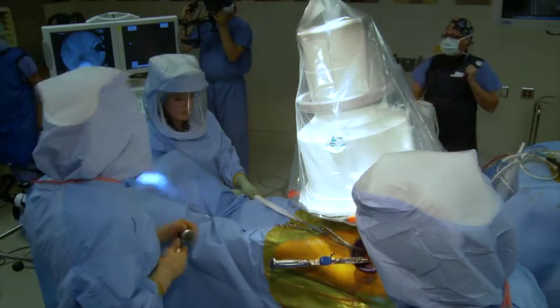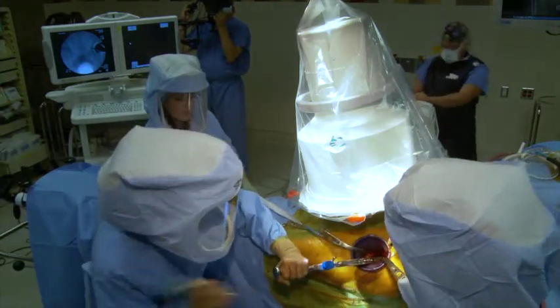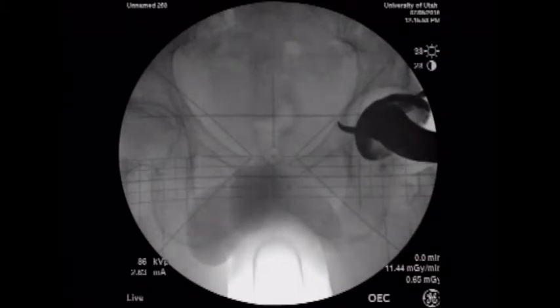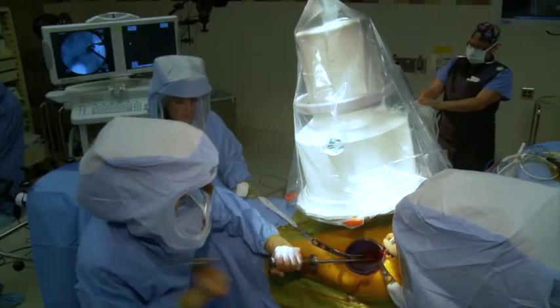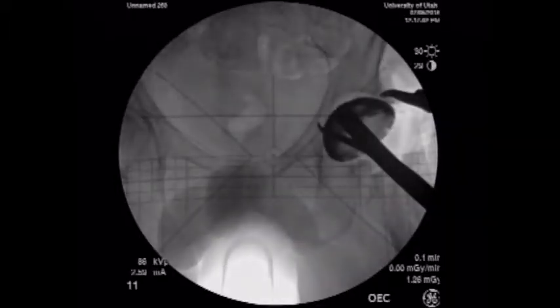I think our abduction and anteversion look pretty good. You know, we just got to get way down in that hole. Shot. Okay, I'm going to get the straight inserter because there's just no way without it on this dude. Shot. Okay, I like that picture better. And I think our overall position in terms of cup position is pretty good.